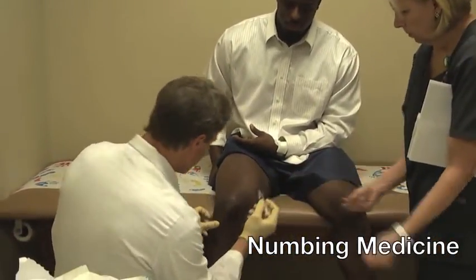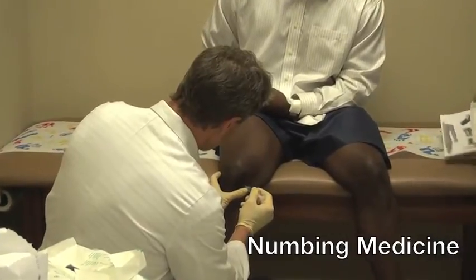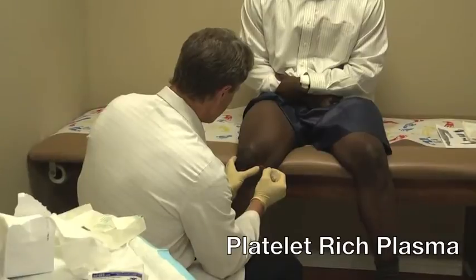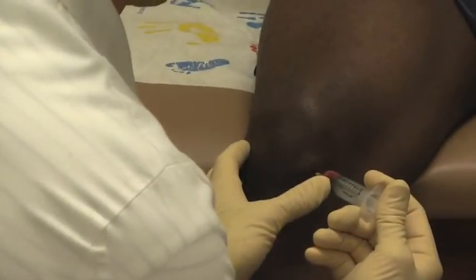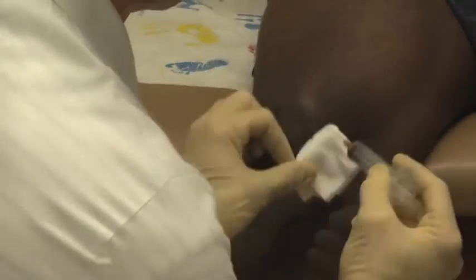Next, we'll prep the patient's knee. In this case, we're going to place the injection directly into the knee. We'll first use a little lidocaine or numbing medicine to anesthetize the skin, and then we'll go through with a larger needle and inject the platelet-rich plasma directly into the knee, or it can be injected into a tendon for certain tendonitis around the knee.